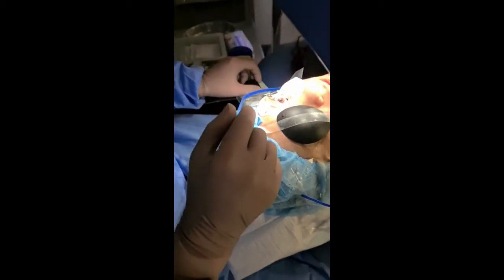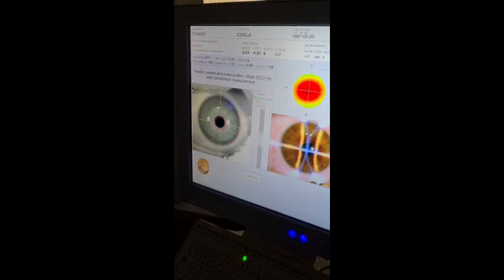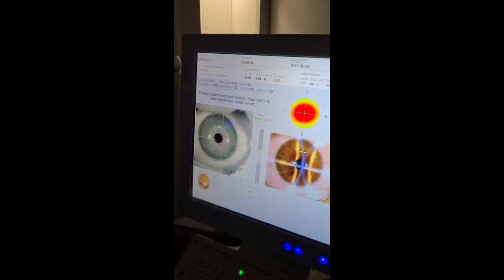Now we're going to line up the laser. Bring it into focus first. So that's in focus. And we'll line up our red target zone. Look straight at the lights. Look at the flashing light.